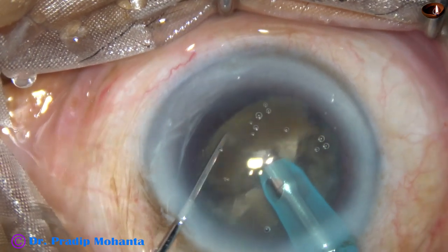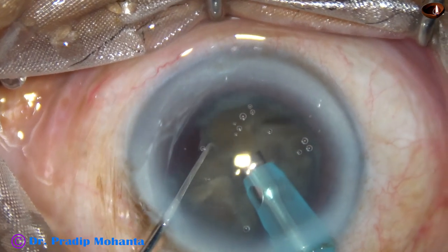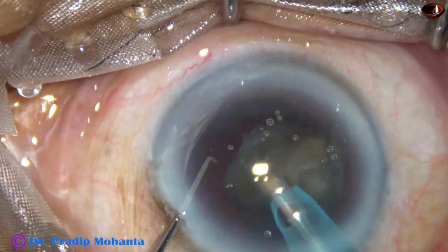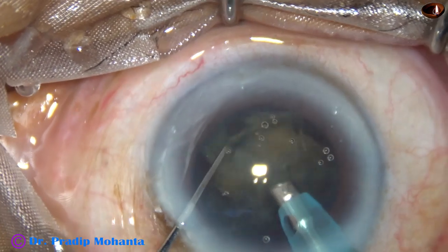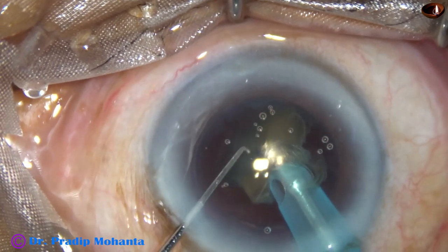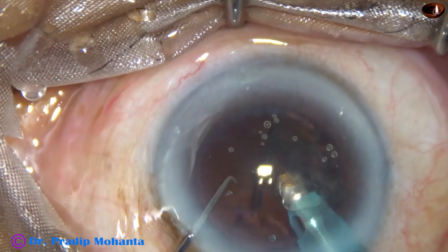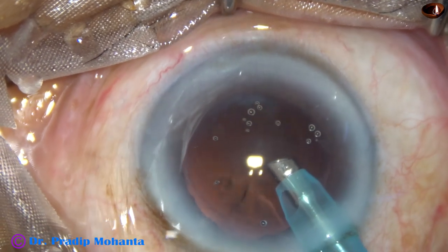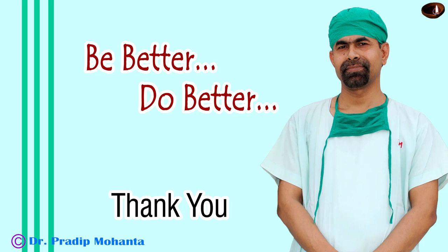At this time, ultrasonic energy is 60%, flow rate is 45 ml per minute, and vacuum is 450 mm of mercury. So this is a very quick, very nice and safe technique, and you should almost master this technique before moving to direct chop. Thank you very much for your attention. Hope this video will help you in developing your surgical skills.